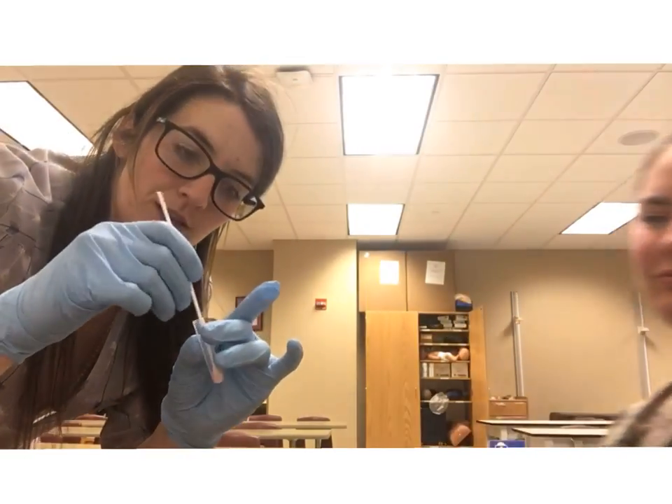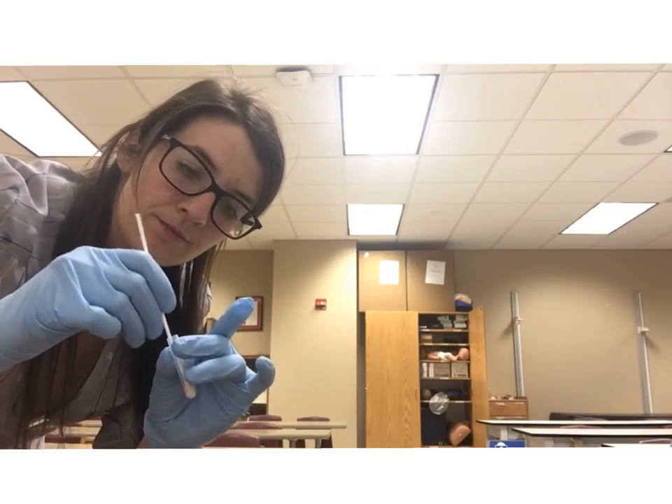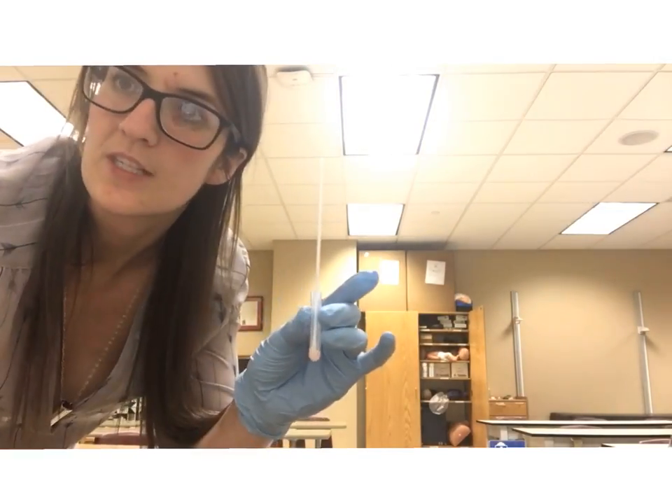Immediately put the swab inside the reagent and swish it around to make sure the entire swab is in the fluid. Now we're going to leave it here for one to two minutes and then come back to finish the test.